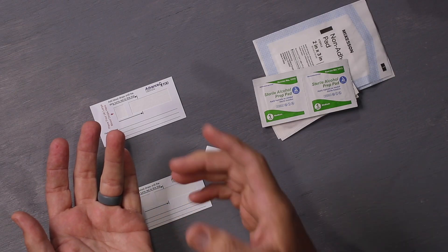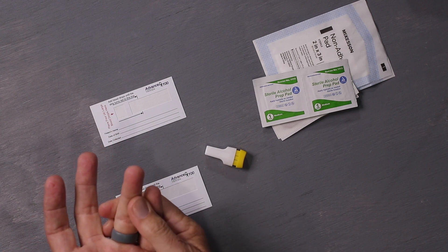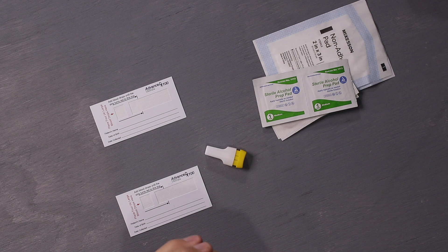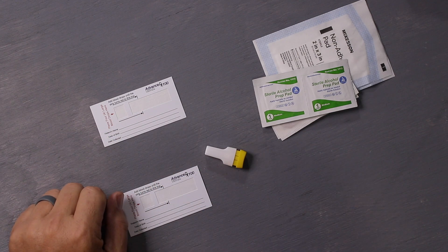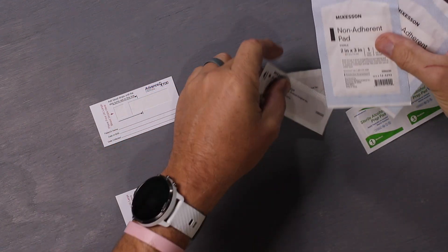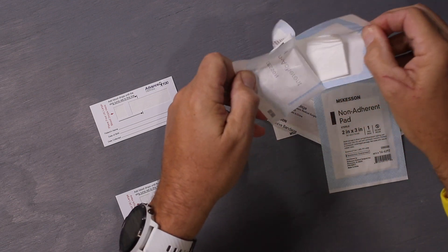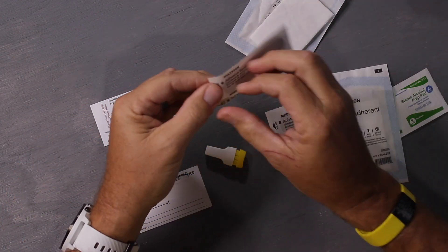Drop the first drop of blood, then 15 to 20 seconds after it pools up on your finger, drop it onto the card, and then 30 to 45 seconds later add the next drop. You're going to do up to four drops to make sure you get enough to fill the card. They give you bandages and pads to soak up any excess blood if needed.